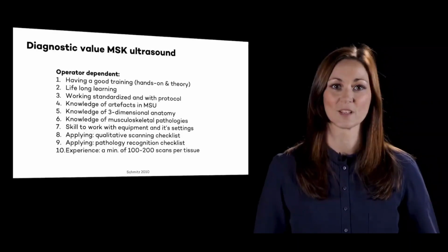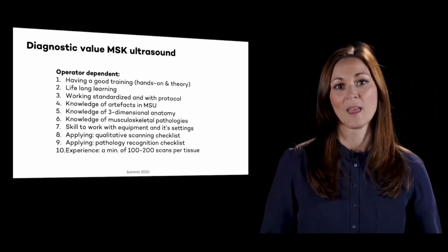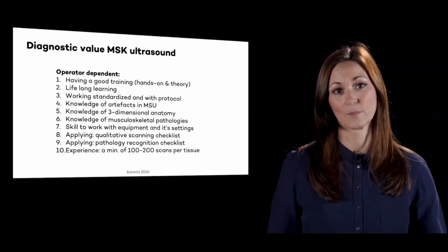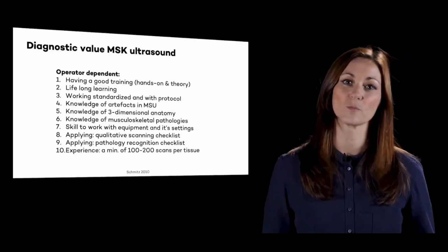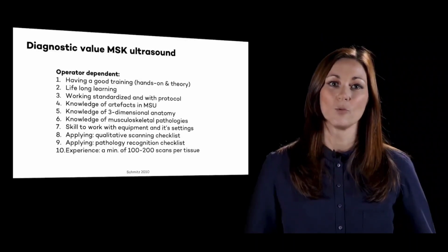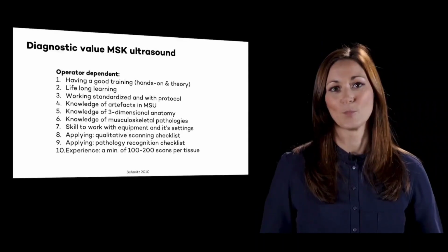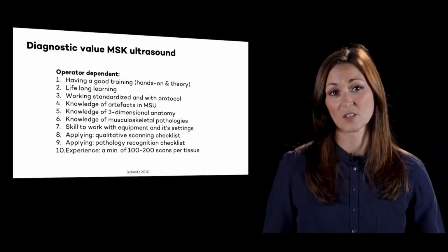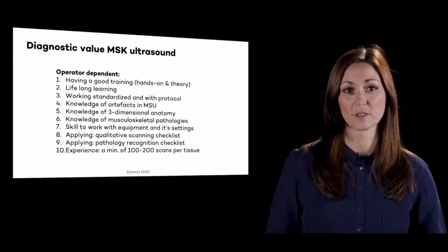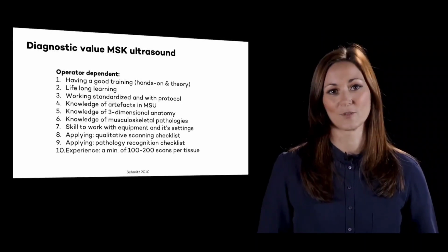The best sonographers assess the patient with one hand holding and steering the transducer and the other hand on the ultrasound system. Every movement with the scanning hand leads to adjusting and optimizing the system's settings with the other hand. This leads to making quality images and more diagnostic accuracy. You will learn in two other presentations about the checklist you'll have to use while scanning. And last but not least, again, make sure you have lots of experience.